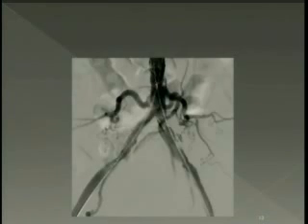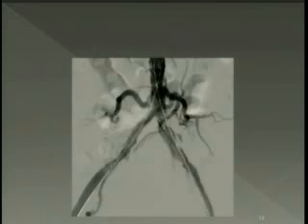What do you think? No, radial, it's a good way. Radial was perfect, but you are on the right side with the catheter, so you can continue to change your catheter. I think this is a learning that we should have come contralateral right in the beginning. Once we tried ipsilateral, we had flaps, we had dissection, so going through contralateral would have been difficult.